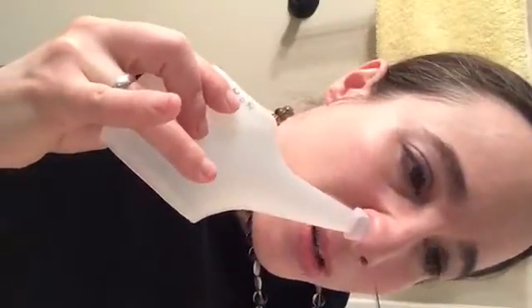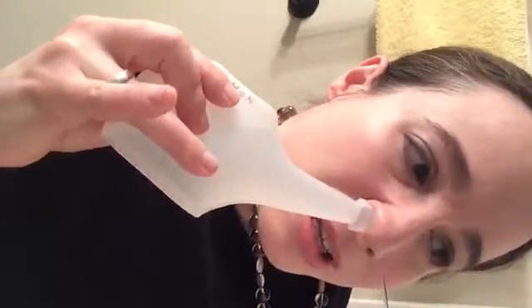And so you want to do about half of the fluid in one nostril. Generally, we'll stop and blow the nose for a moment to get the stuff that's come out already on that side. And then very simple, you take your head and go in the other direction.